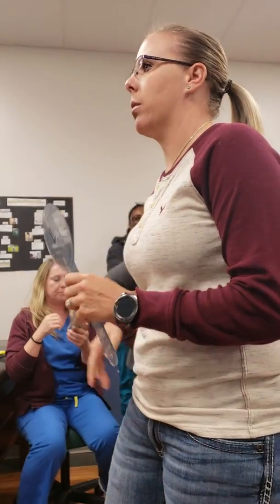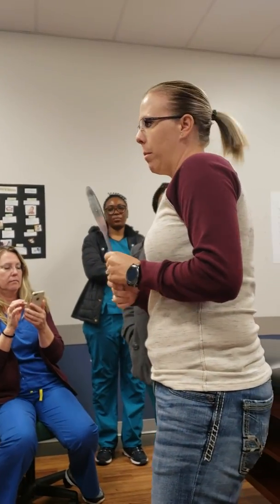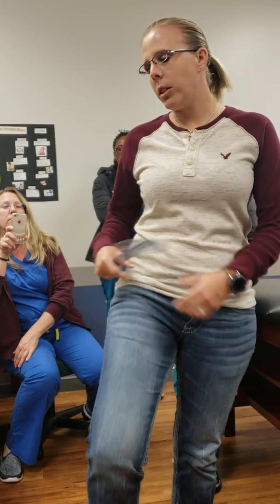What do you guys think the axis would be? What do you think the stationary is? Greater trochanter, because we're going to be on lateral flexion, hip flexion. Hip flexion first.